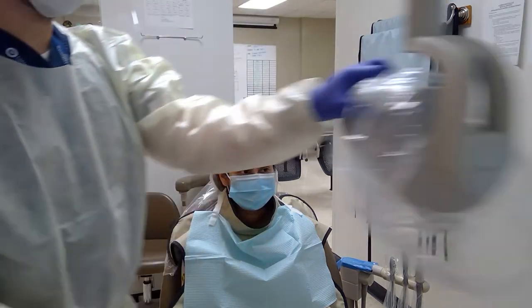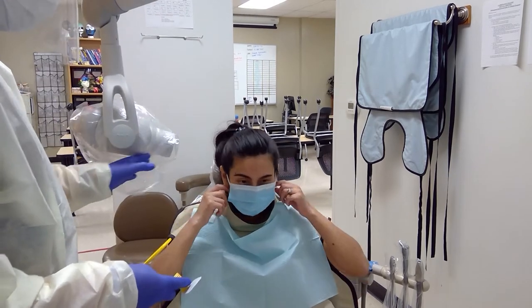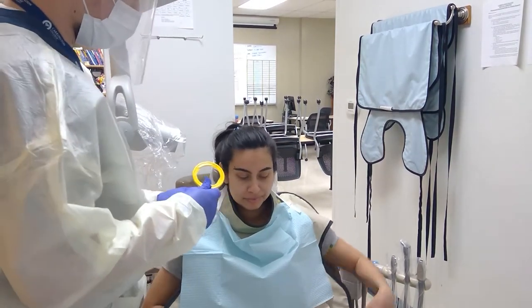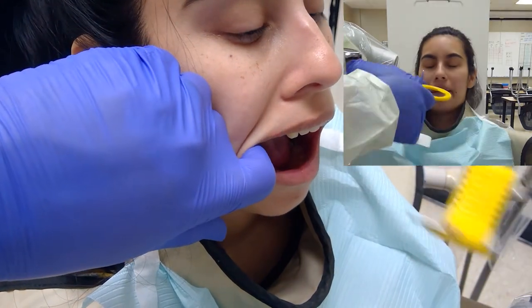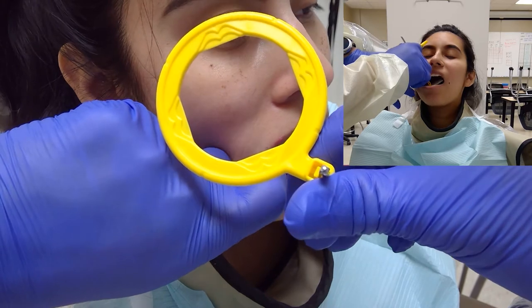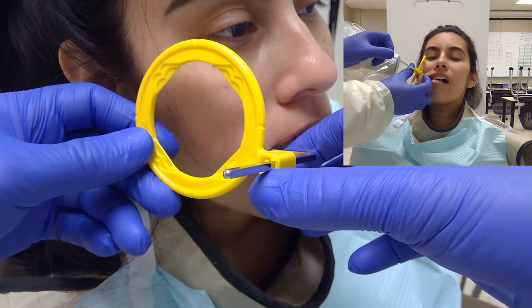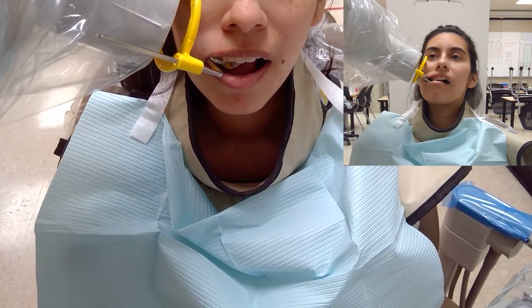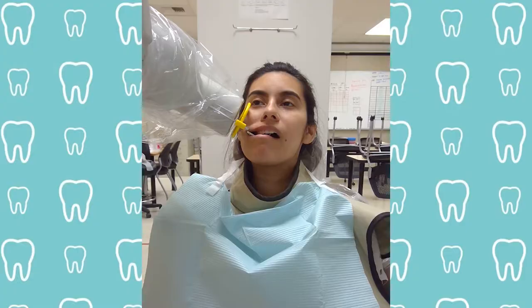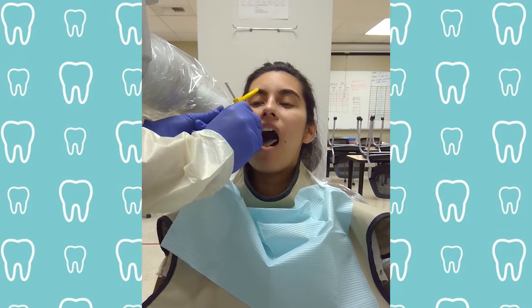Ready your x-ray equipment so that you have your tube head near the area that you're going to be x-raying, and also have your equipment such as the Rin XCP ring set or the snap arrays. Instruct your patient to remove their mask and begin taking your films. Starting on the patient's right side, pull their cheek a little bit to the side and roll the film into place. Have them bite down to secure it, making sure it's in proper placement, then push the ring into place. Bring over the tube head, aim, and then step out of the room. Once the x-ray has finished, go and remove the tube head from the site. Pull back the ring gently and then remove it by unrolling it from the mouth.